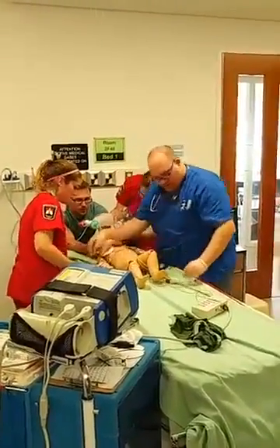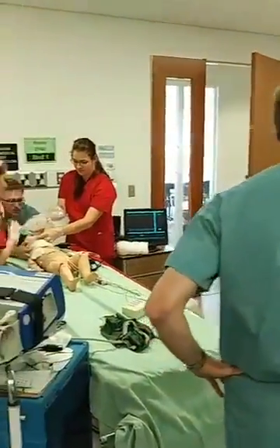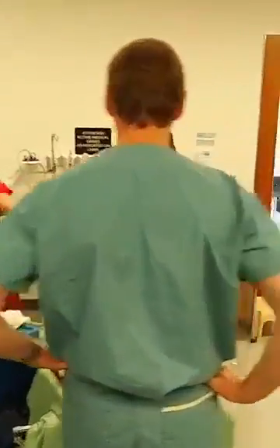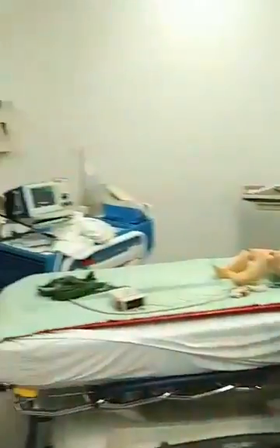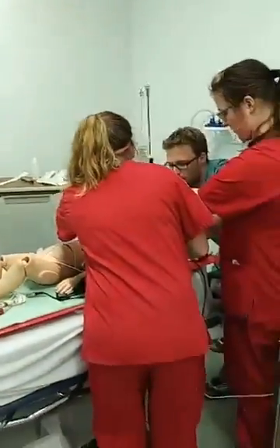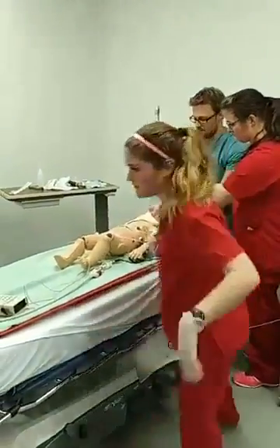Back good. Okay. Chest still moving well? Yeah. Do you want me to call trauma surgeon? Yes, please. Okay. Guys, I need those sandbags or rolls back, please. Yeah. Let's get those back in. Maintain just there by the monitor. Okay. So that's about 98. So we're starting to top up a bit there. We're at about 110. I'll slide this hand out. Other hand out. Perfect.